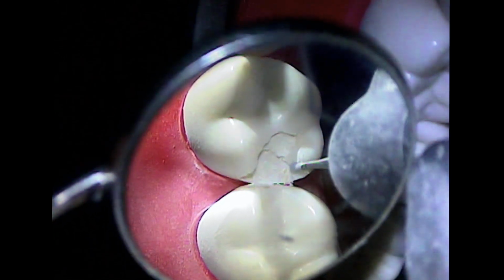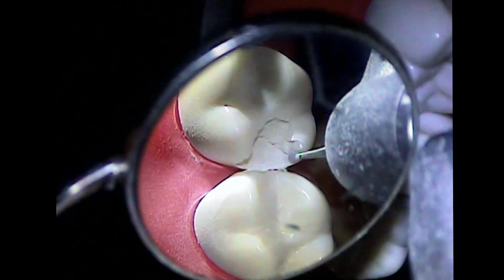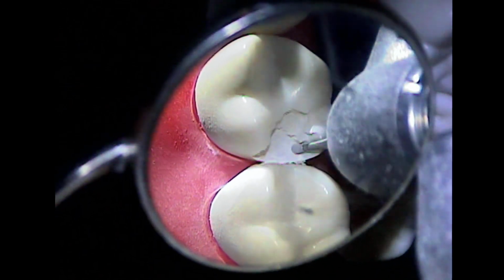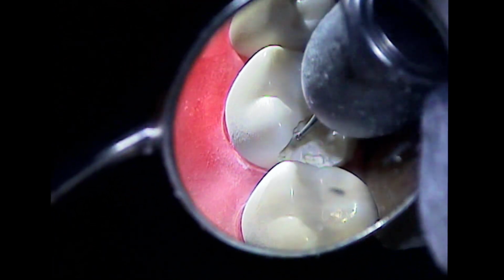So we certainly need to come back and clean this up. Define the margin, define the angle, get a nice flat wall. Then we can find the corner of the box about right here. And come away from that wall that way. I'm going to make this a little bit less acute on the facial.